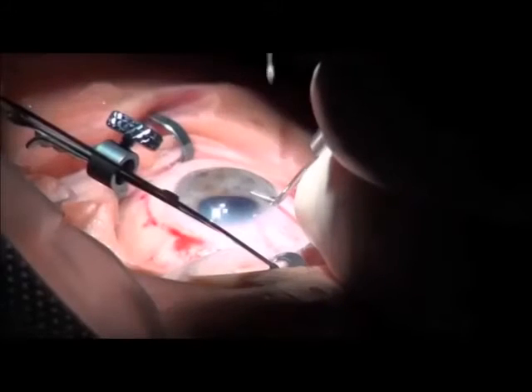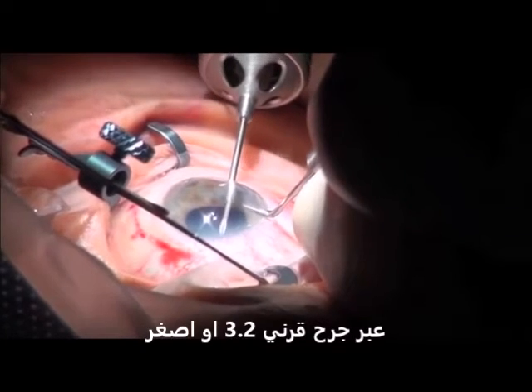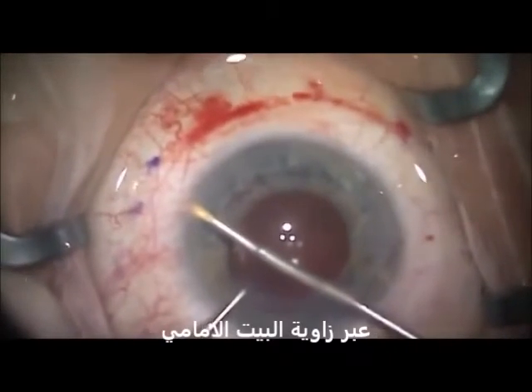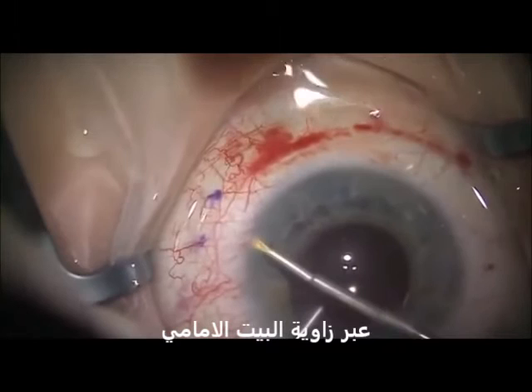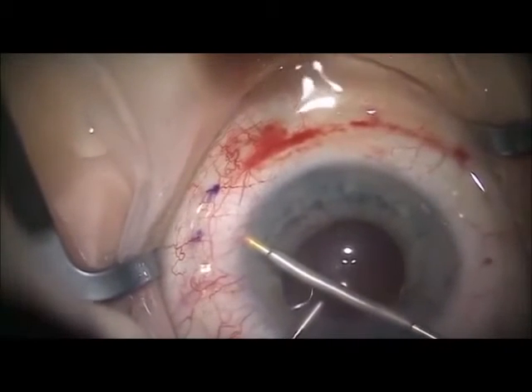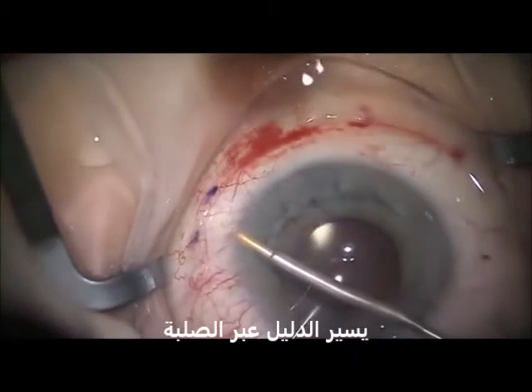The injector enters the 1.8-millimeter clear corneal incision and travels across the eye to the superior nasal quadrant where the stent will be placed. The Zen gel stent creates a patented channel through the sclera, allowing aqueous humor to flow from the anterior chamber to the sub-conjunctival space. The Zen gel stent is positioned closer to the iris than to the endothelium, so there is no endothelial touch.